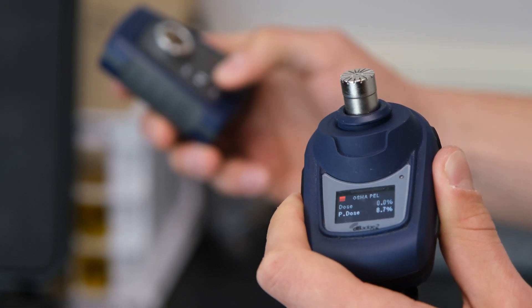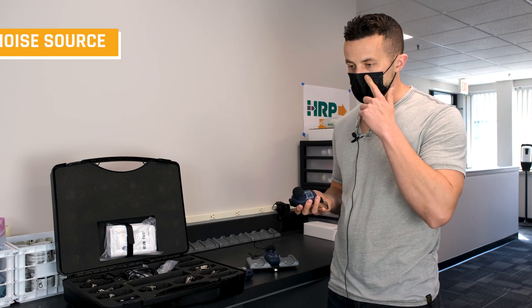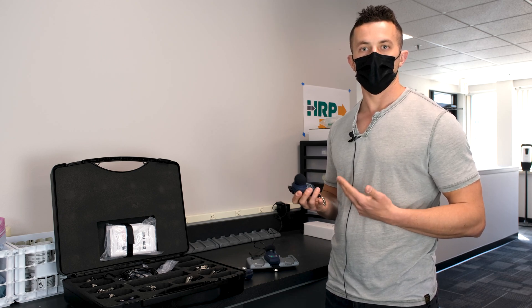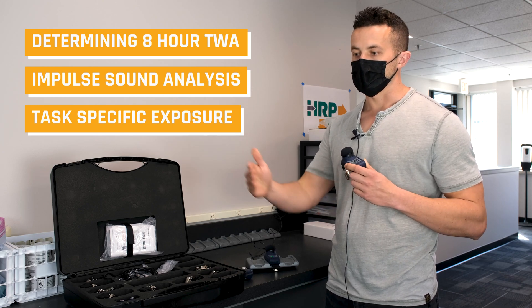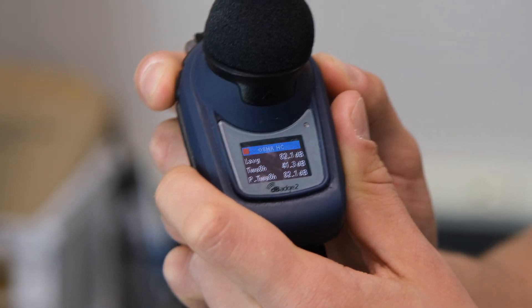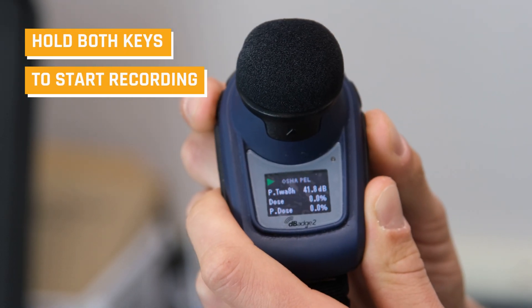Remove the calibrator, turn it off, place the windscreen back on — now we're ready to begin our sampling. We go up to our worker, whoever we've identified as needing sampling due to a new noise source, a job hazard analysis, or some other hazard analysis technique. What the dosimeters are really good for is determining that eight-hour time-weighted average or a short noise impulse over 15 minutes. To begin the sample, hold down the upper right and left buttons for three seconds and it's going to start recording.